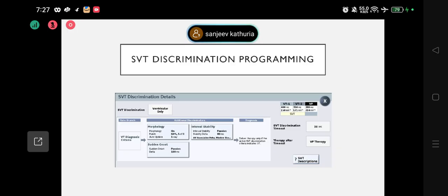It was not a sudden onset, it was a gradual onset, but the gradual onset was also VT. Next time it will reprogram the gradual onset window. The gradual onset window reaches a heart rate of 220. This time it will change it. The machine will automatically do it: 210 is also VT, so it will change the value. What you used to do as programmers, most of the time the machine is doing. But remember, interval stability, morphology, sudden onset, offset, all in VT.